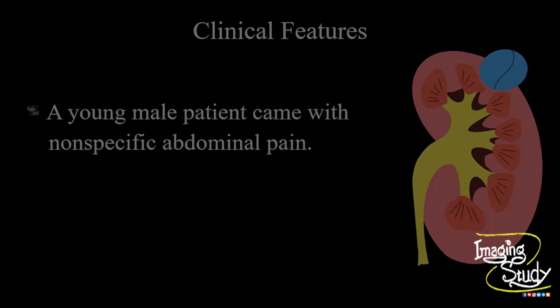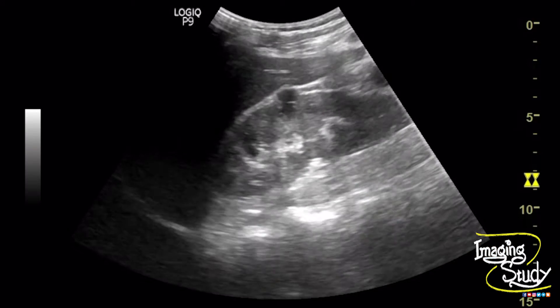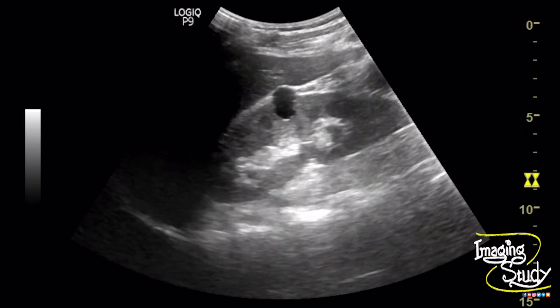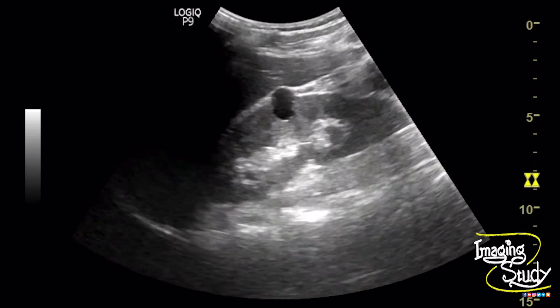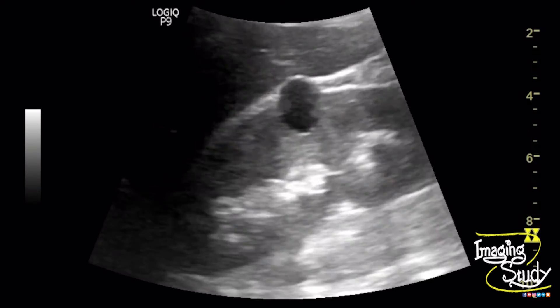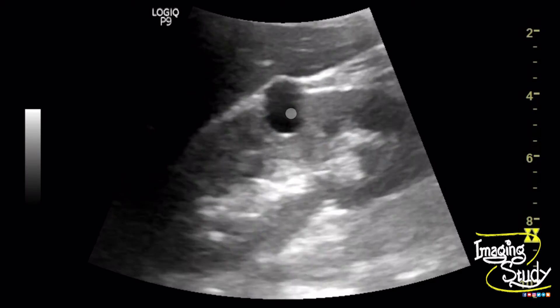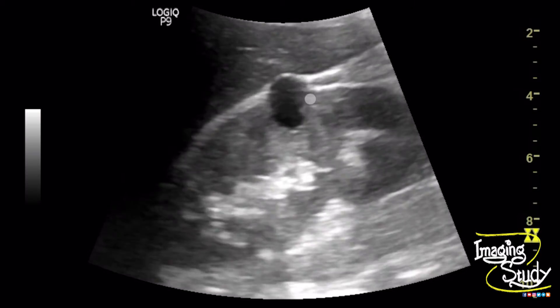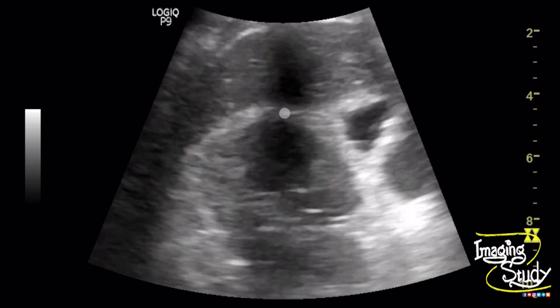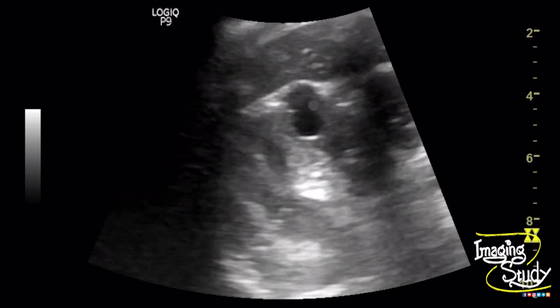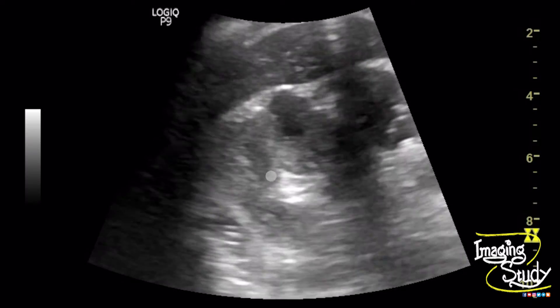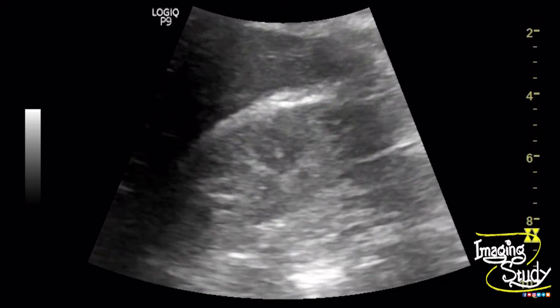On real time, you can see the longitudinal section of the right kidney showing a small anechoic cystic structure at the interpolar cortical region. It is also visualized in magnified images in both transverse and longitudinal sections.